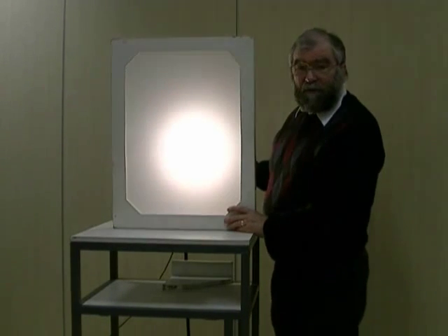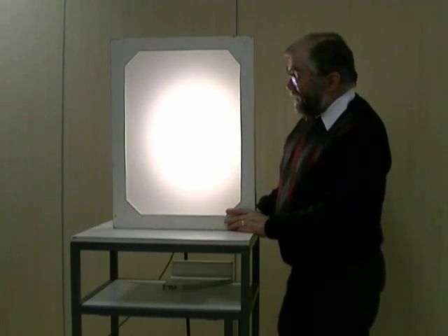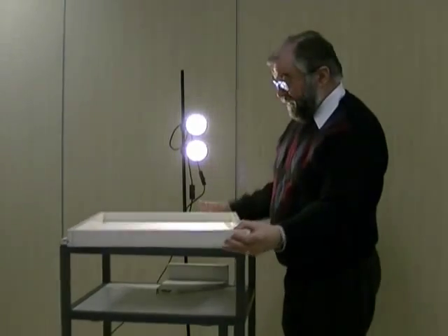If I turn one of the sources on and off, all that happens is that the overall picture gets dimmer and brighter. We don't resolve the two sources — we can't tell there are two separate sources there at all. That's because we don't have any collimator.